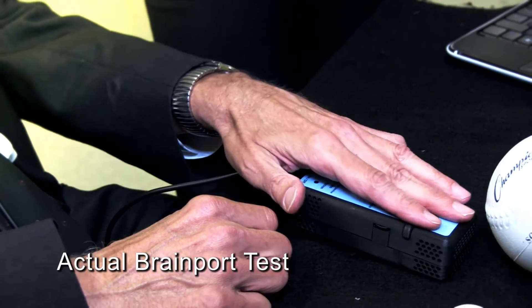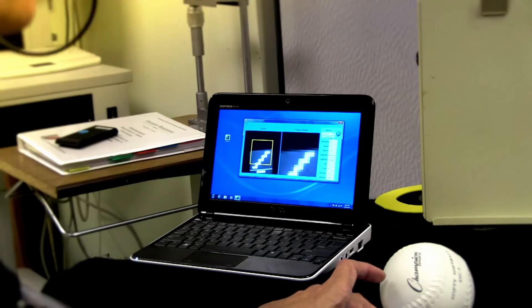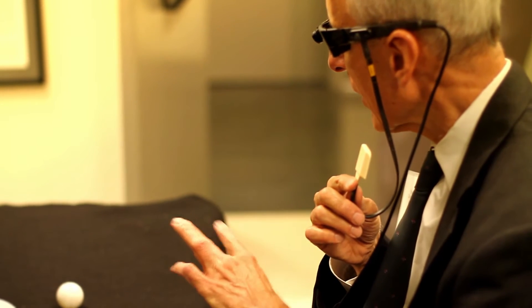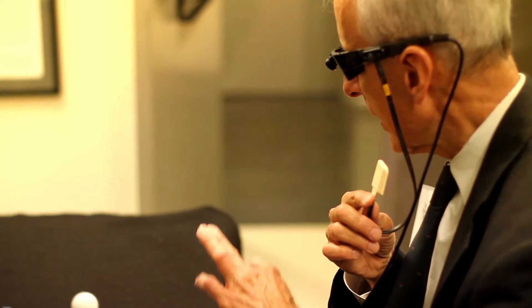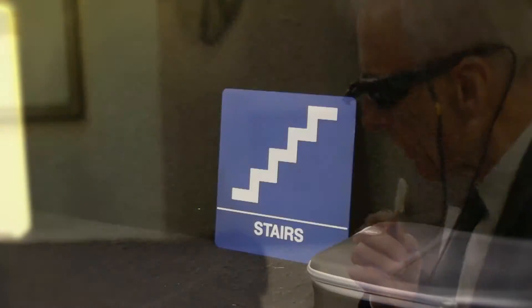You can zoom in with the dial on the right to explore it a little bit more. It reminds me of the stairway one. Very nice. Yes, it's the stairs. It's because you could feel a diagonal line and then a bottom line, and it was sort of like the railing and the stairs coming in there.